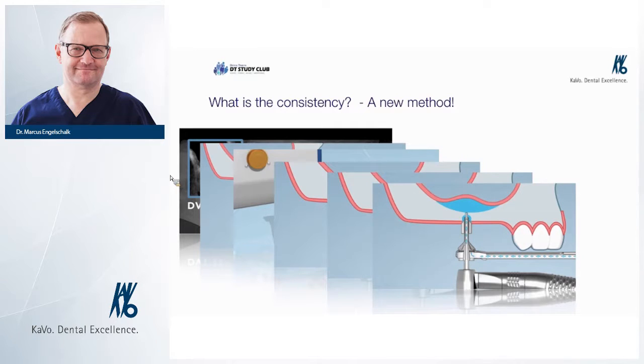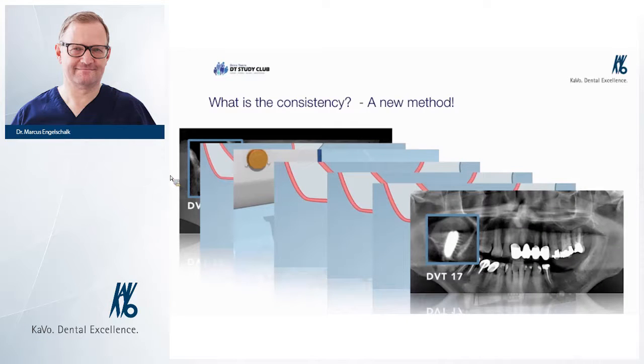Then I think every technique you will use is risky. Often we have to do this, then we will perform the external window, because we're not able to handle this with 1 millimeter with the internal sinus floor techniques. To be honest, sometimes we need the external window, but most we don't need it. So this is very interesting. So it gives us a hint: sinus septa, residual bone height less than 3.5 millimeters.